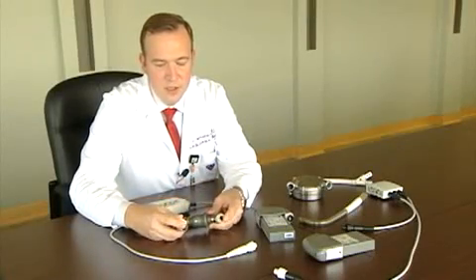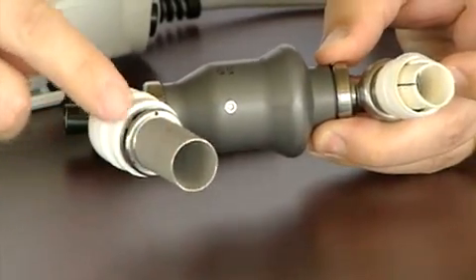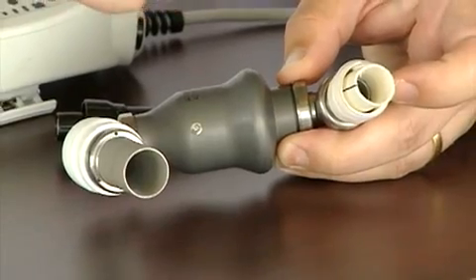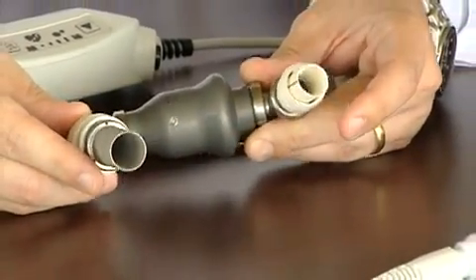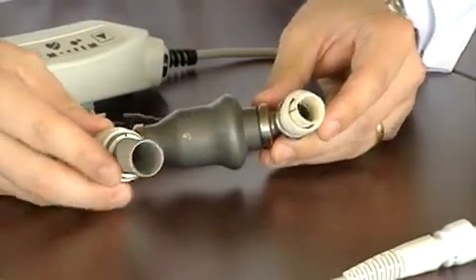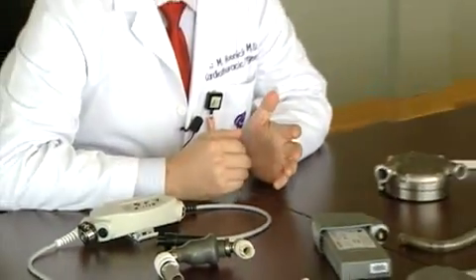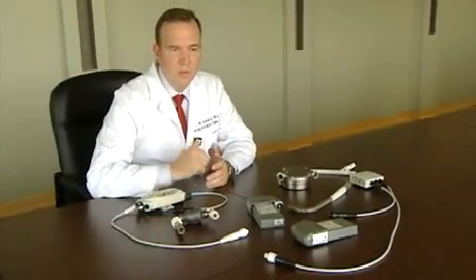This portion of the device is connected to the patient's left ventricle, and the blood is taken through here and is pumped through this device and up to the aorta. So it essentially is in parallel to the body's native circulation, but it takes over for the left ventricle. So really, your left ventricle is not squeezing at all after this is implanted, and this is doing all the work for your heart.